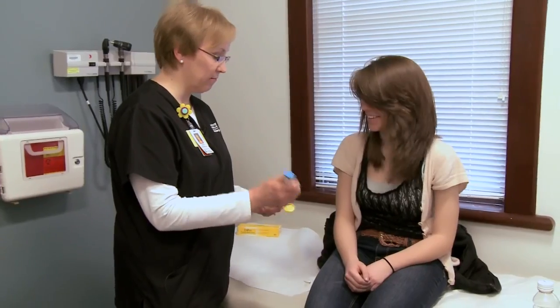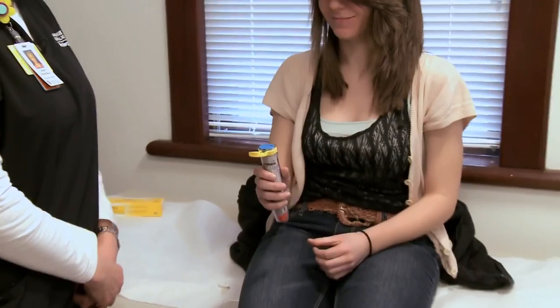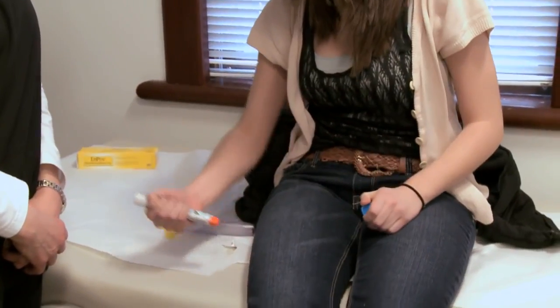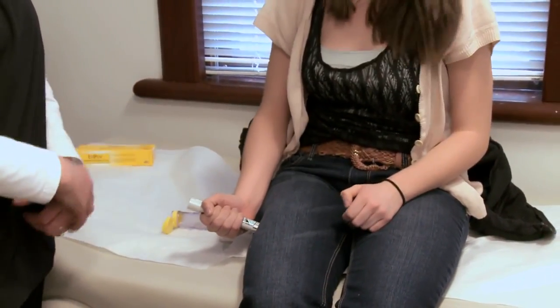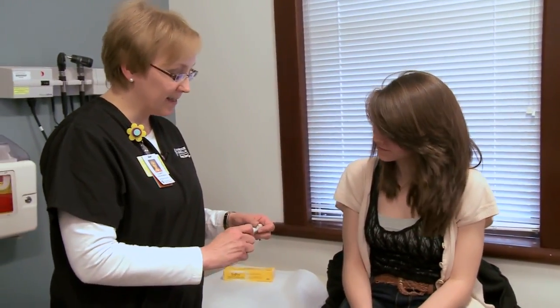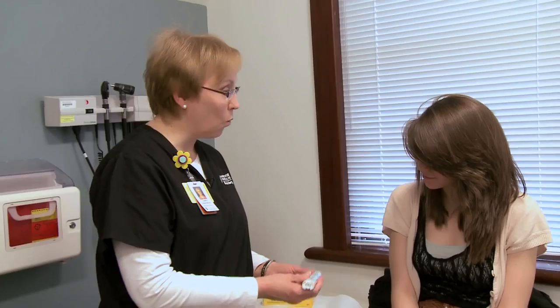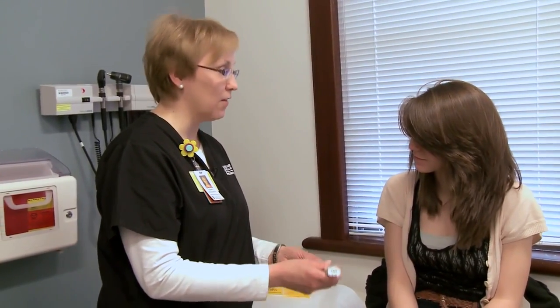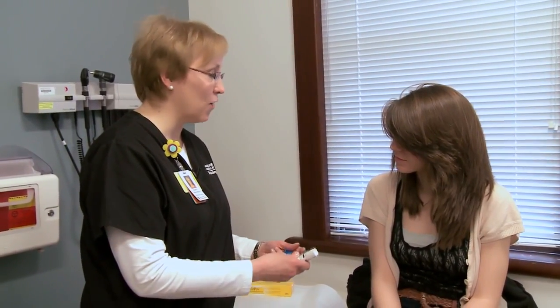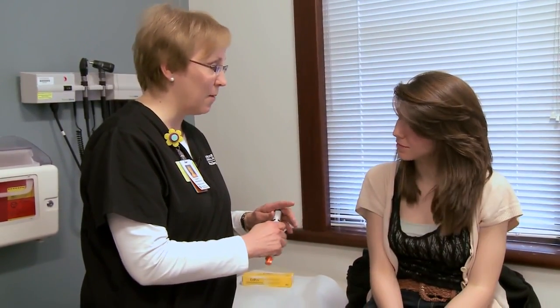Let's do it from the real beginning. When you feel like you need the EpiPen, you're going to give it. Slide it out into a nice fist, take the cap off, and inject. Hold it in place for 10 seconds, then pull it out. The hardest part is holding it in place that long — people's instinct is to inject and pull right back out. But this is a one-shot device. If you pull it out too soon, you'll lose the medicine into the air and won't get the chance to give it again with that EpiPen.